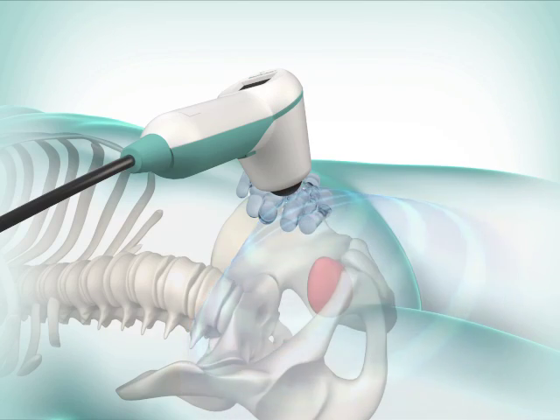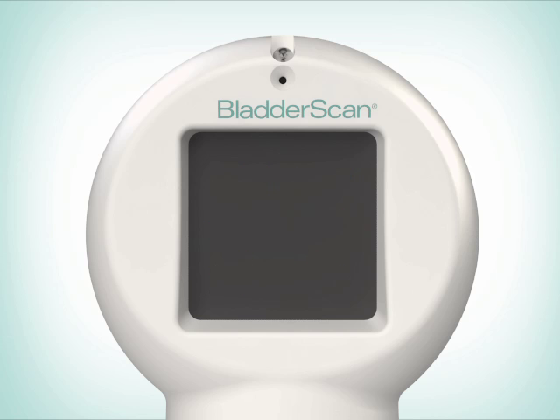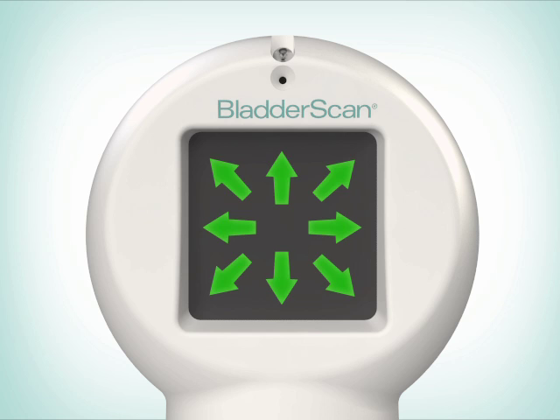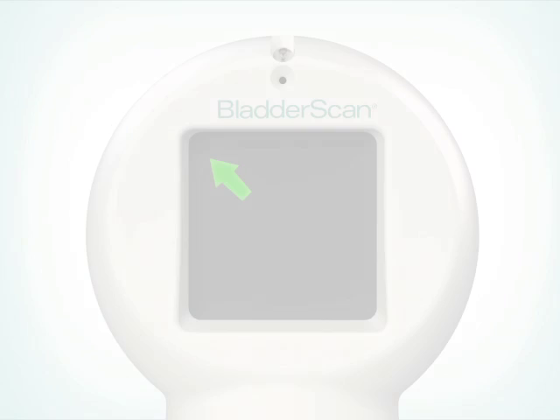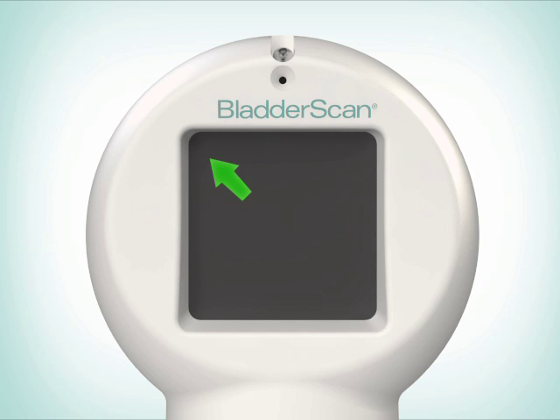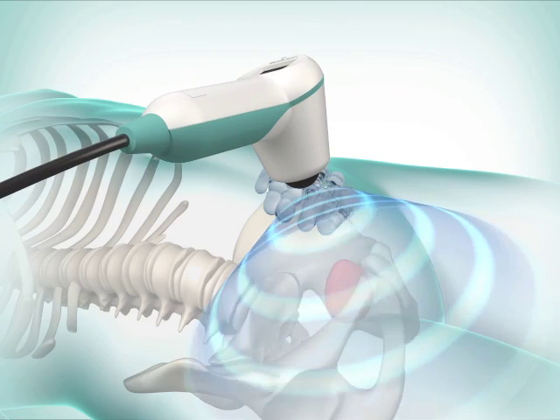When you hear a beep, the scan is complete and a bladder volume measurement is displayed on the console. The aim is accurate when all eight arrows are flashing on the probe and the bladder image is centered in the crosshairs of the console's aiming icon. If the scan is off target, the arrows on the probe indicate the direction of the bladder. Use these arrows to re-aim the probe for a more accurate scan.